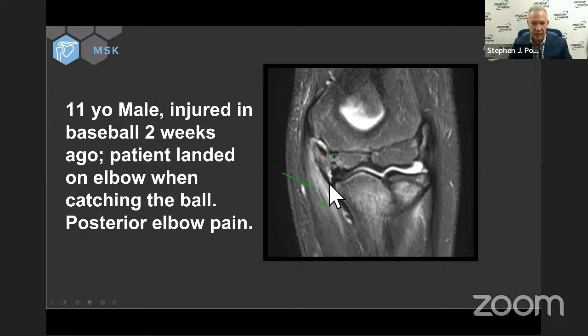There is the distal anterior bundle of the UCL. There is a little slit right here. Hard to know whether that's just a recess or a tear because it's only about a half to three quarters of a millimeter. I suspect it's a normal one, but all the abnormalities are up here where the patient has avulsed a piece of bone. There's swelling of the proximal UCL. Now, this is a real proximal UCL injury with avulsed bone, with diffuse swelling in the adjacent flexor pronator mass.